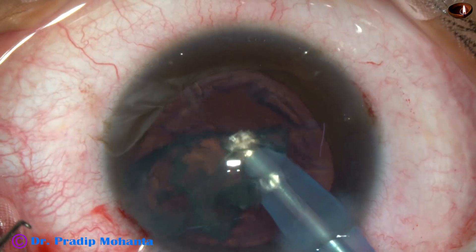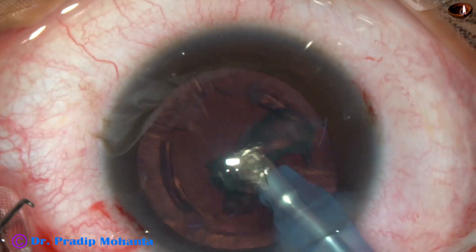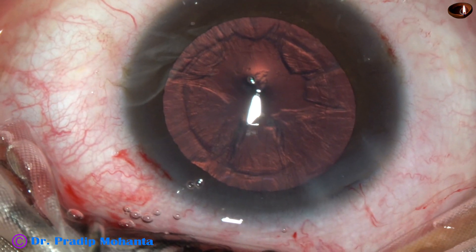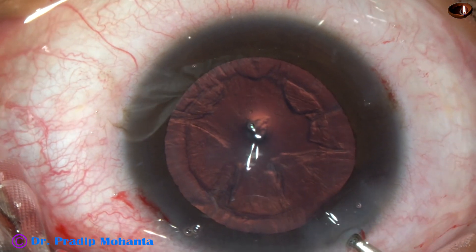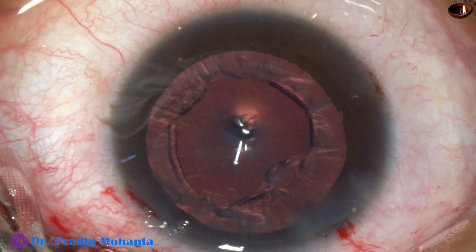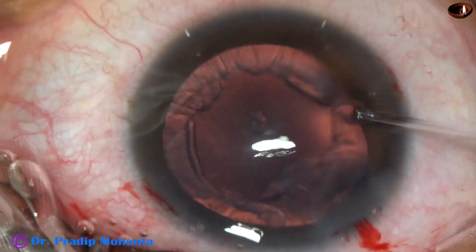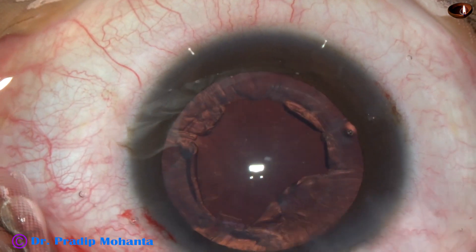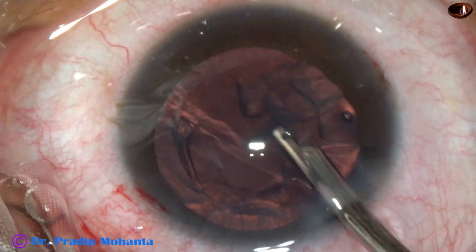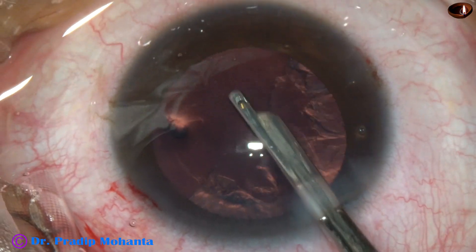And now at this time, the bevel of the needle is up towards the cornea, and it is done. So, with a soft cataract, if the lens gets tilted by hydrodissection, just start eating it up. This was a soft cataract — it can be managed without using ultrasonic energy. But if we use about 10 to 20% ultrasonic energy, it gets removed faster, and we must not spend a lot of time in the anterior chamber.